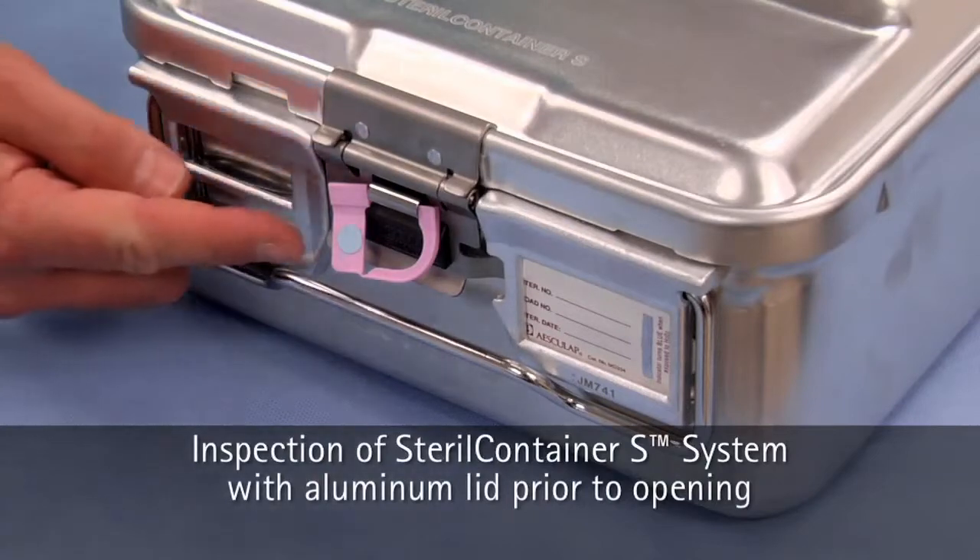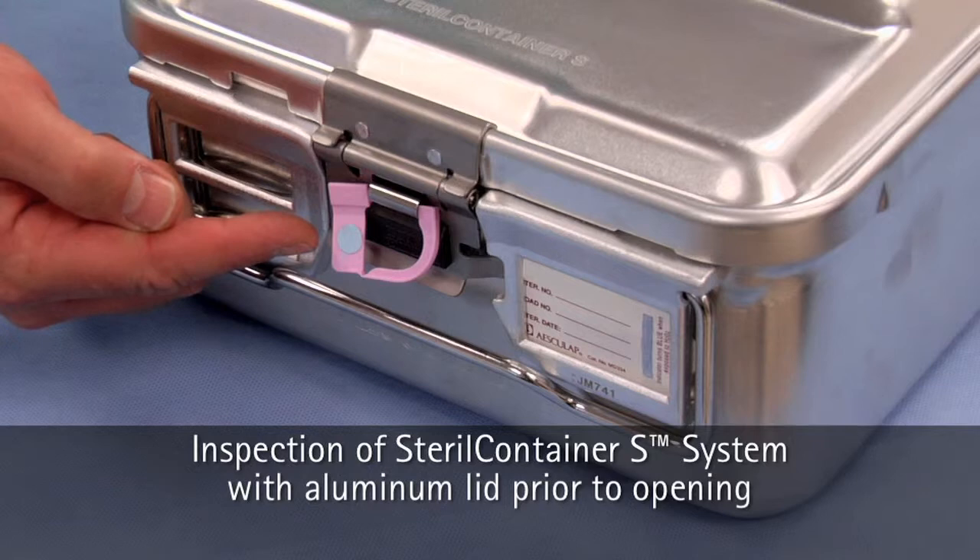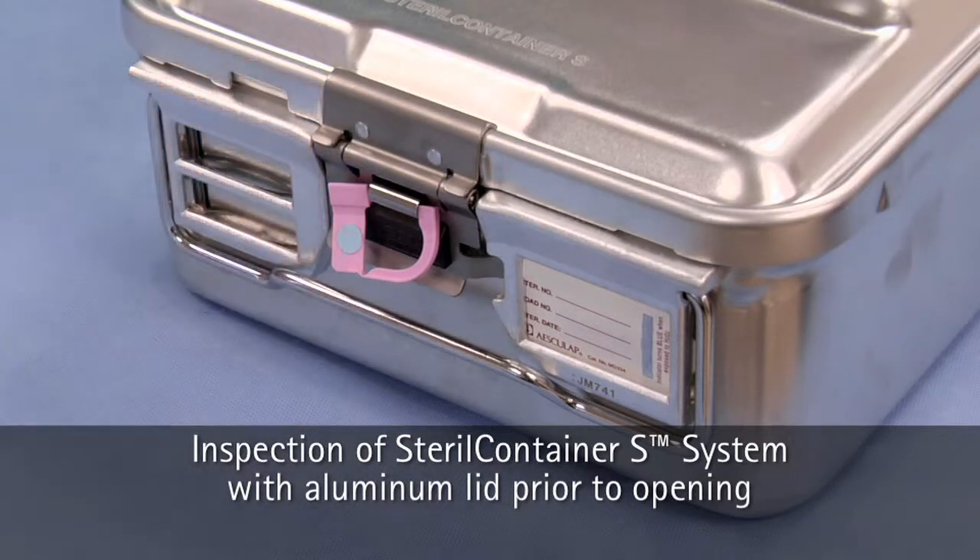Inspect the physical integrity of the closed container system by making sure the tamper-proof locks are intact and that the external process indicators show evidence of the sterilization process.